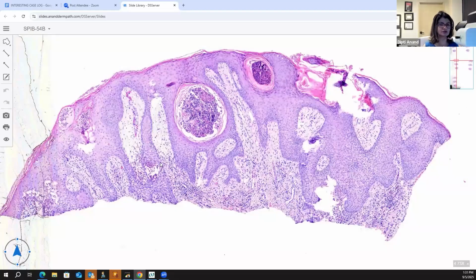You will always see them. They will be a distractor. You often see them on the thigh. You often see them on the scalp. You will see them in intertriginous sites. You will sometimes see them on the lip. Sometimes biopsies from the face can have a ton of plasma cells. So I just ignored them.